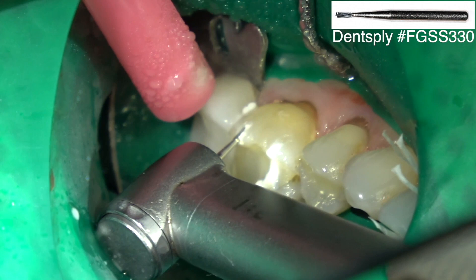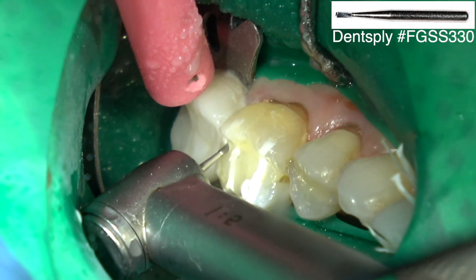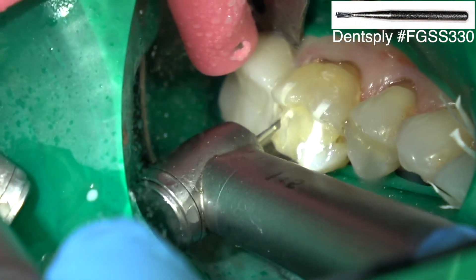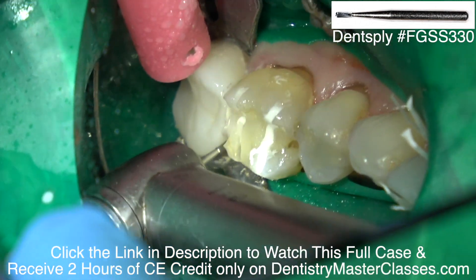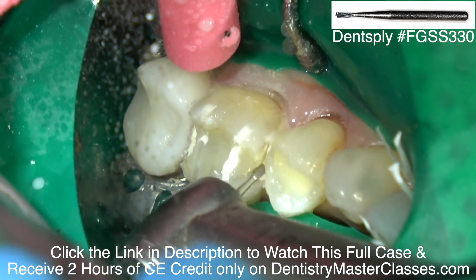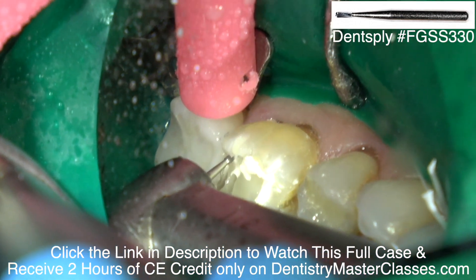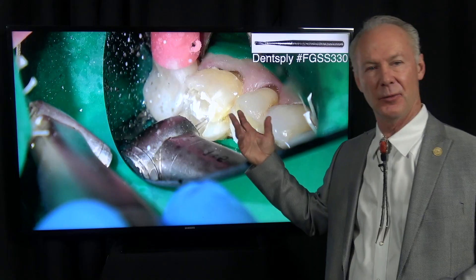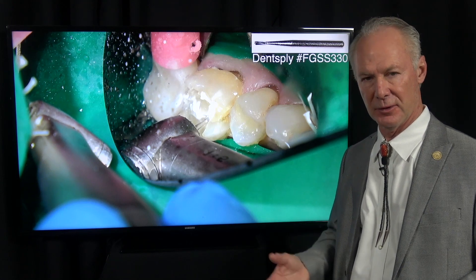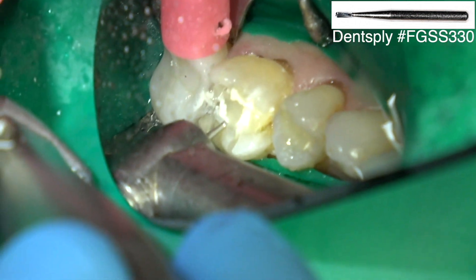You'll see I'm first prepping the first molar for a crown because it had a large interproximal filling crack on the tooth. It wasn't sensitive. Now what if a tooth had been hypersensitive? If it's hypersensitive preoperatively, I'm going to perform endodontics on that tooth 99% of the time, because the last thing you want is for a tooth to be hypersensitive once you place the restoration. You don't want to have to do endodontics through a crown because it compromises the longevity of the crown.